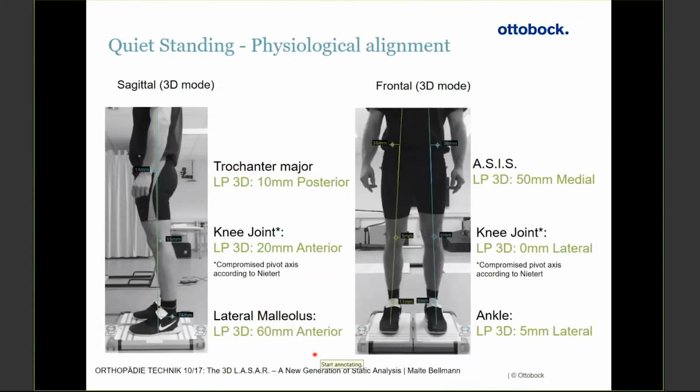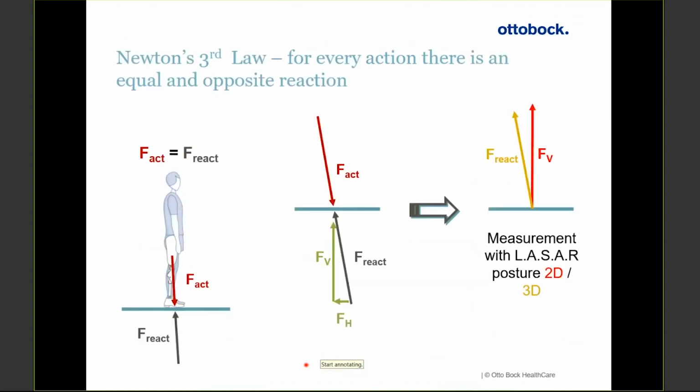But here that shear is really important. Not to interrupt you, Aideen, but that shear that you showed on the previous slide, that's really important for you in transfemoral, because that's indicative of what you're achieving at heel strike. So that shear at the point of contact at the floor tells us a lot about how that device is acting. And it can also preserve stability or cause it to become unstable. Yeah, thank you, Jerry.